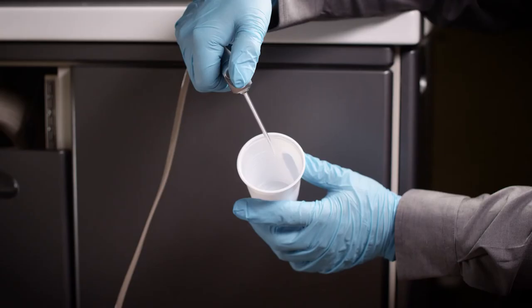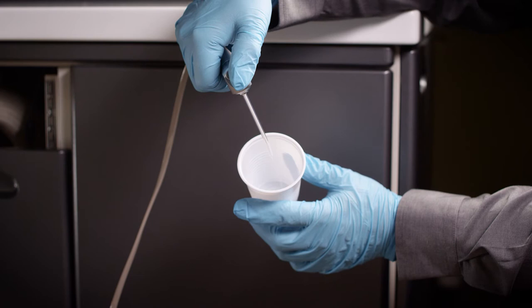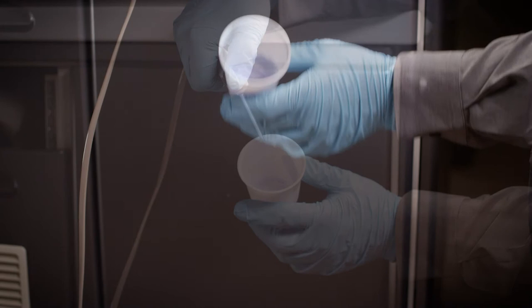Attach the filled bottle to the chair with the straw installed. Purge hand pieces and all other water lines into a small container until you see the blue coloring come through. Stop water flow once you see the blue color — this indicates the shock treatment is in the lines. Repeat this step for each dental water line.